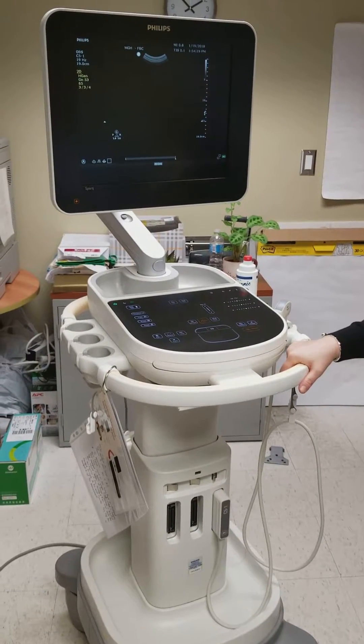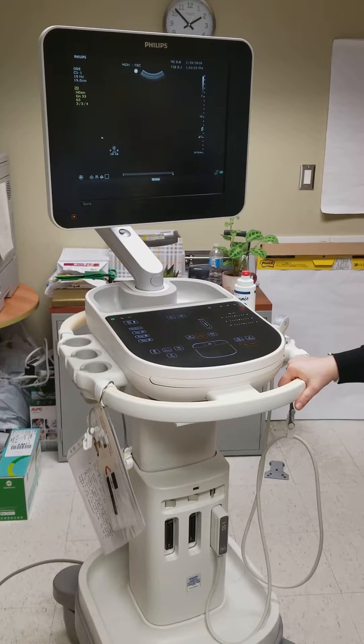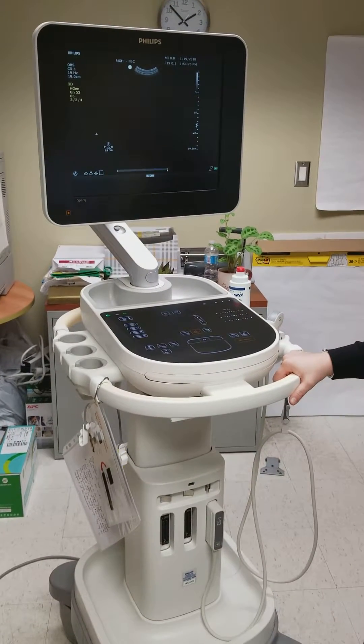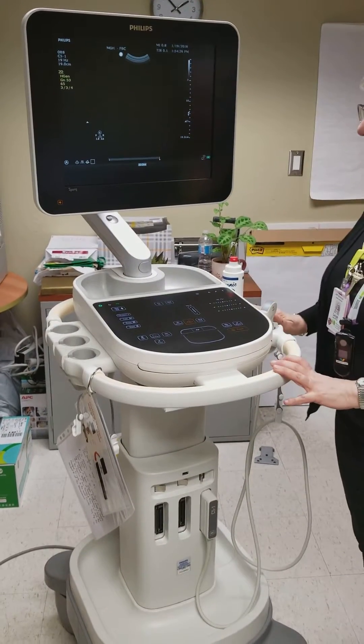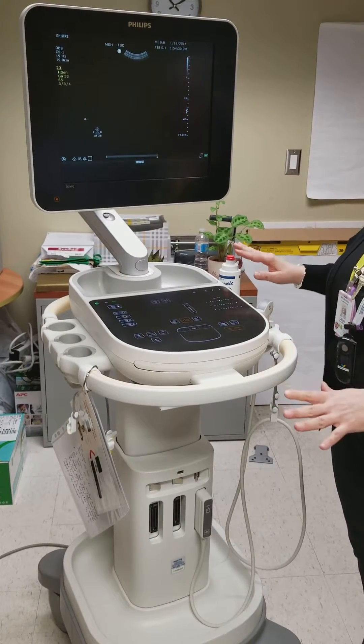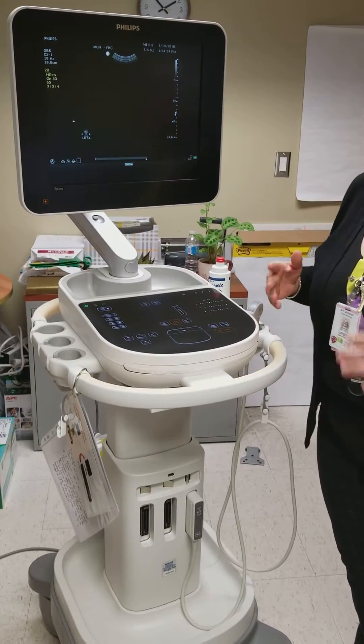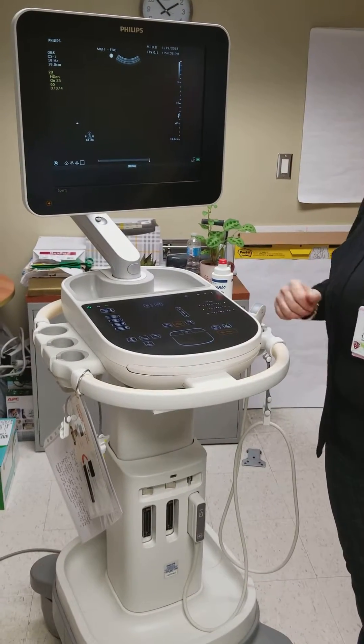Hi everybody, this is the new ultrasound machine. It's called Spark, and we've nicknamed it Sparky. I just want to go over some of the features that you need to know about as nursing staff. You will not be using the machine, but you may be required to turn it on, turn it off, and move it from place to place.